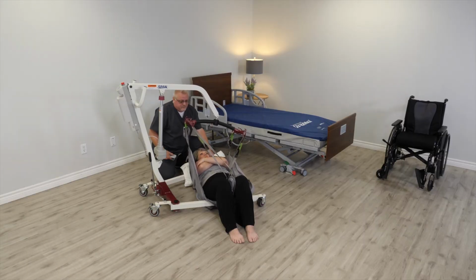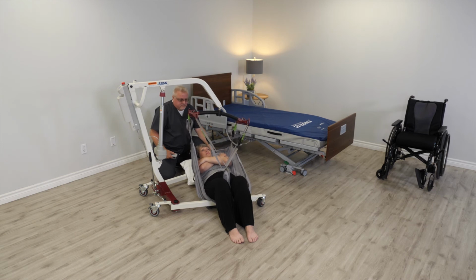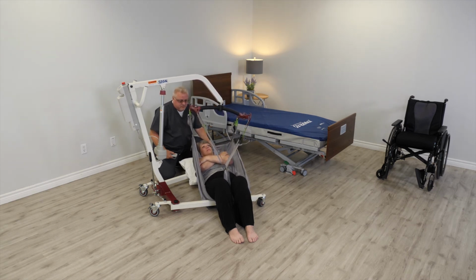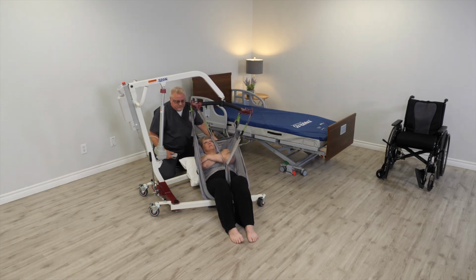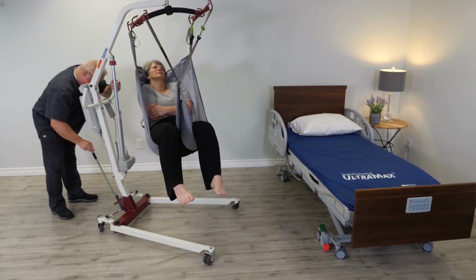Then slowly raise the patient until the slack has been eliminated, pausing long enough to confirm the straps are not twisted and the patient is securely and properly positioned before resuming. Then complete the lift. The patient is now ready to be transferred to bed or chair.